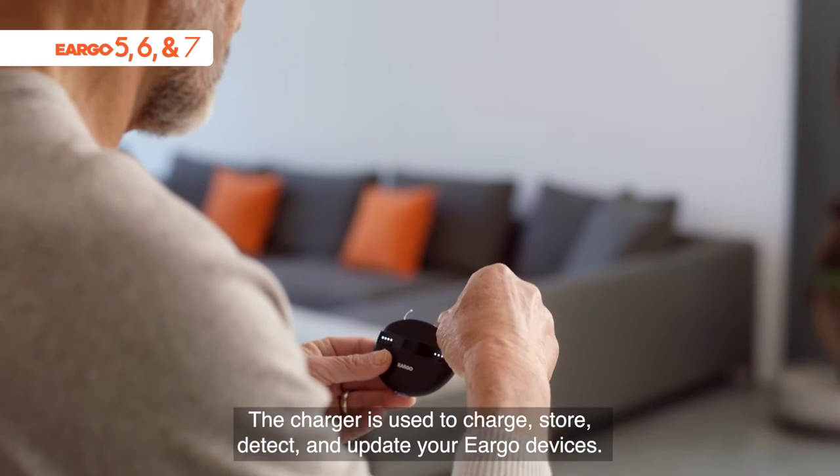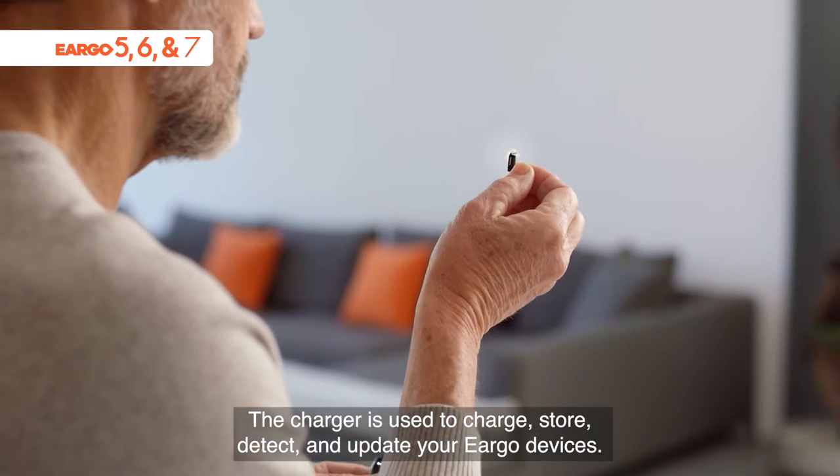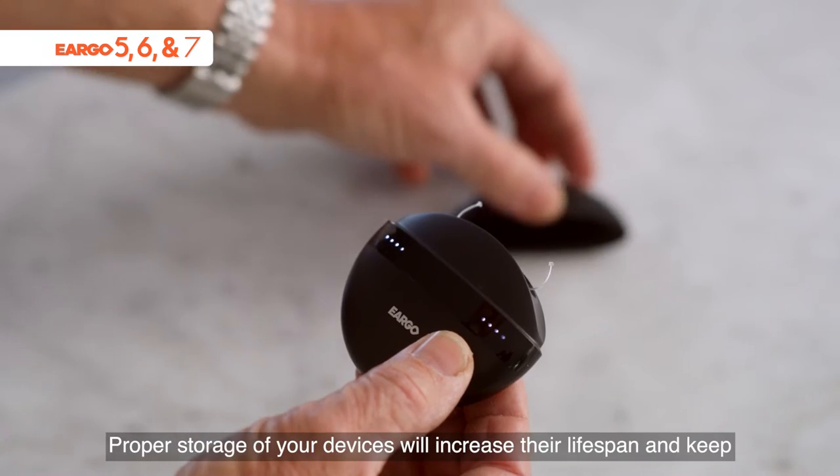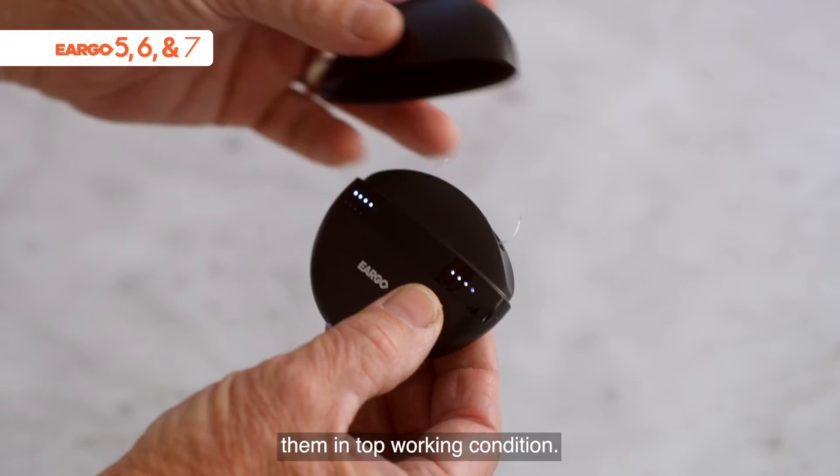The charger is used to charge, store, detect, and update your Eargo devices. Proper storage of your devices will increase their lifespan and keep them in top working condition.